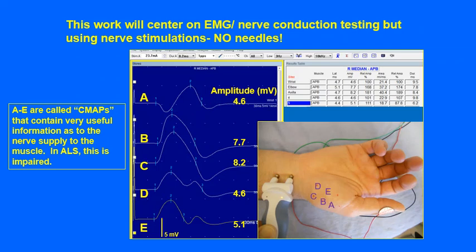The signal we get when we stimulate a motor nerve — where you see the stimulator in the bottom right box where the hand is — we stimulate and then record signals. There are different recording sites labeled A, B, C, D, E. The best signal came from position C, so it's important that after we get a sufficient stimulus we move the recording electrode around to get the best signal, and that's the entire basis of this project.